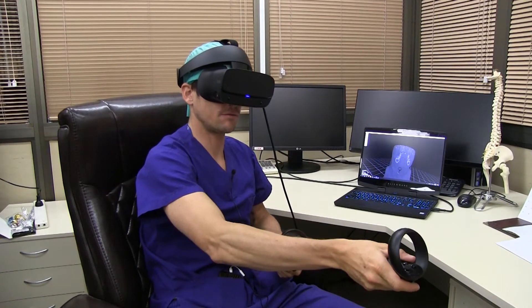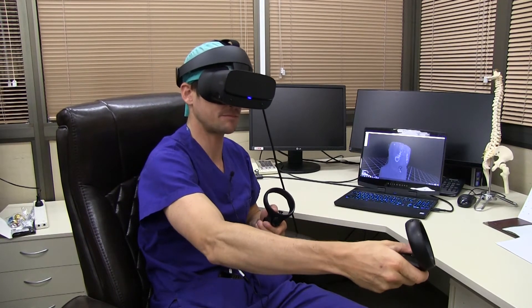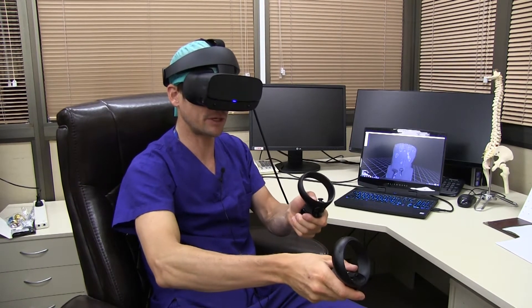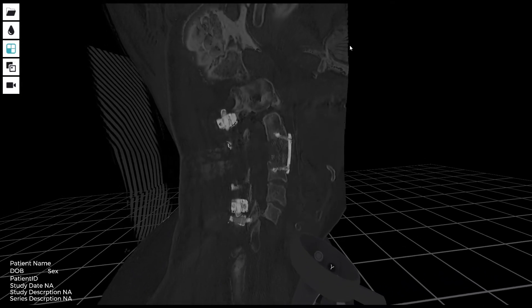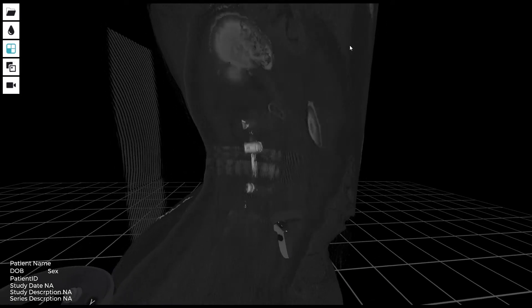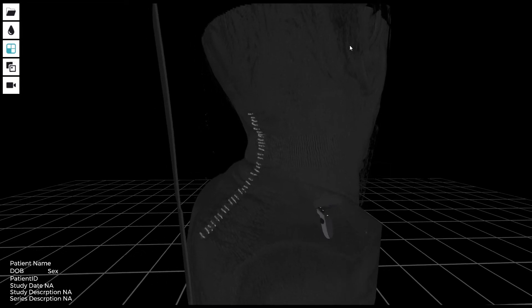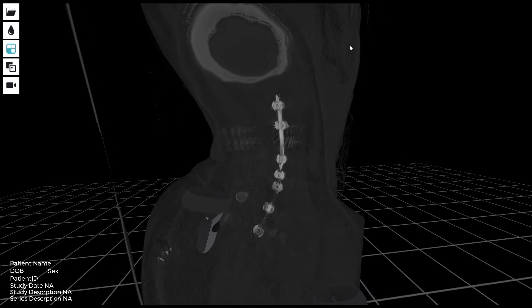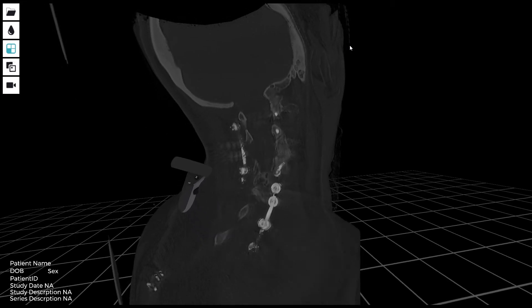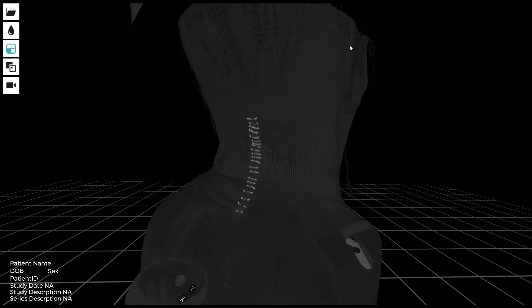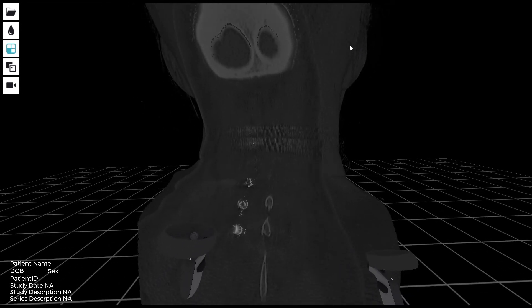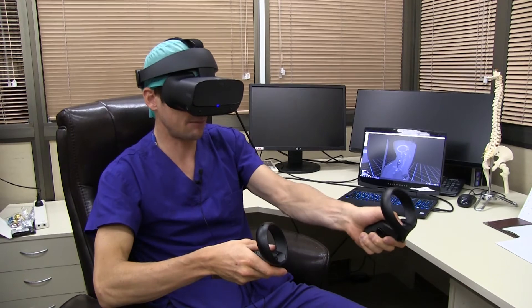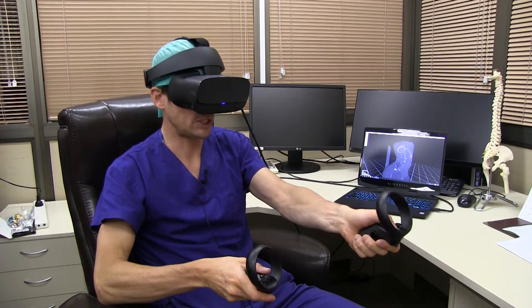Now I use MedVR to check the post-operative scan of this patient. We did a 360 stabilization with a corpectomy and a plate. I can see here the position of my cage and the plates, the screws, and we also did a posterior approach. I can even see here the staples. We placed lateral mass and pedicle screws with rods, and I can appreciate all the hardware placed from the back and from the front. I can use any plane to see the alignment of the spine, which has been reduced now.